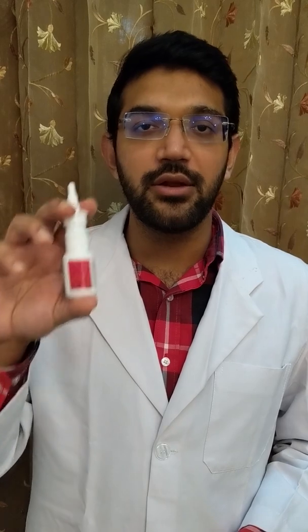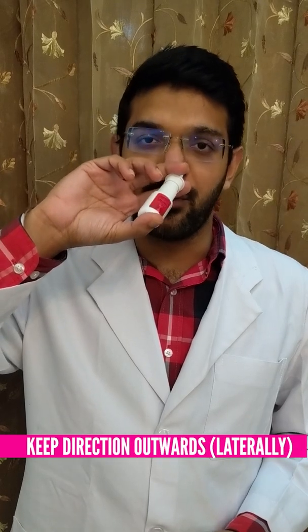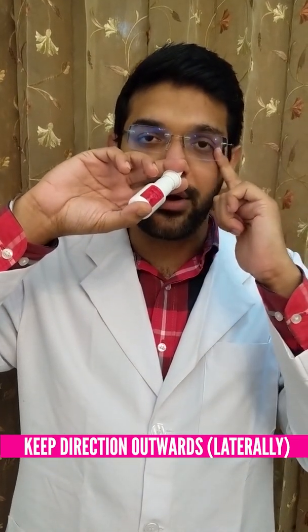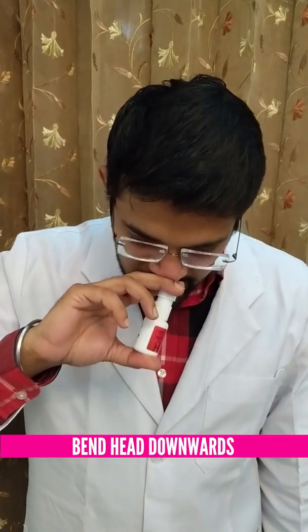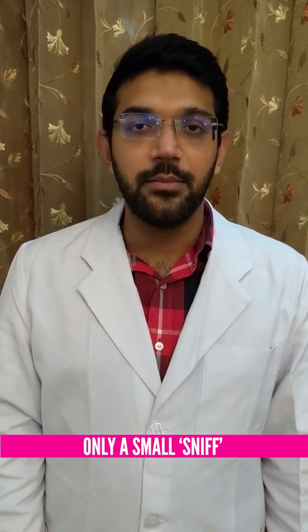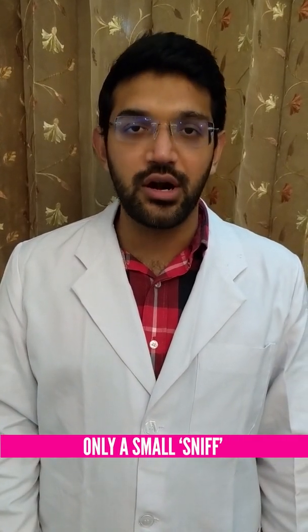If we have to put the spray in our left nostril, we hold the spray in our right hand. We insert the spray into the nostril keeping its direction a little outwards. The direction should roughly correspond towards the outer corner of the eye. We bend our head downwards and spray it once. After this, we need to hold our breath for 10 to 15 seconds. We can sniff a little bit, but a forceful inspiration should not be done.